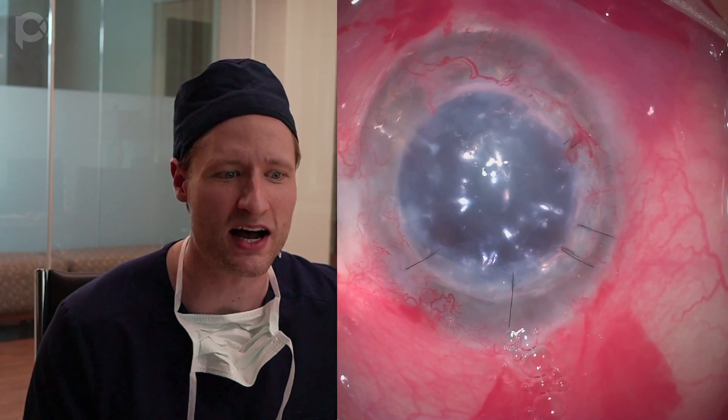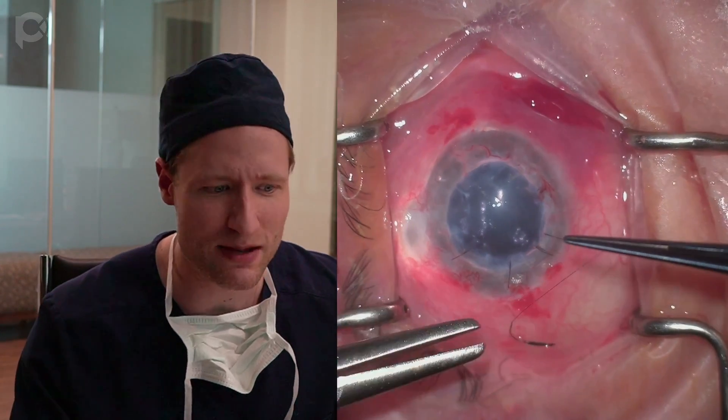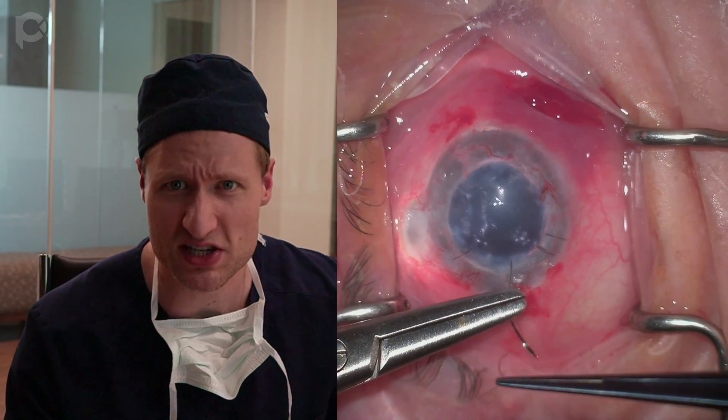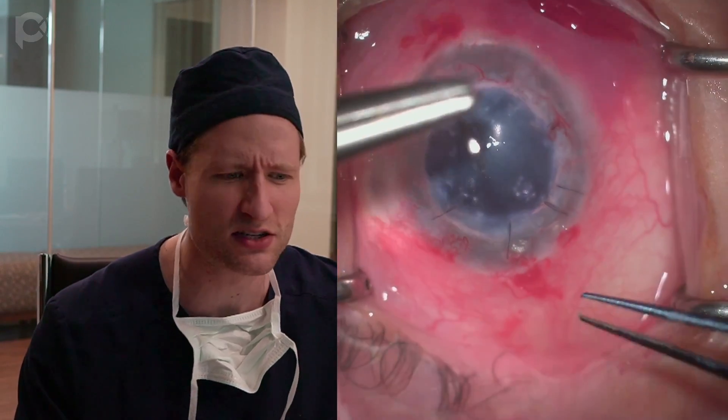Now I'm pressurizing the eye with an air bubble. This is what the eye looks like at the end of the case. A peripheral iridotomy was made. I'm going to put a stitch in the main wound just for safety's sake — I don't normally do that, but for this gentleman who came from far away with only one eye, I think it's a nice addition. The key learning point: if you have a PK, it's always better to try to rehabilitate that PK with a DMEK than to just throw in the towel and do a new PK. You'd be shocked what quality of vision you can achieve.